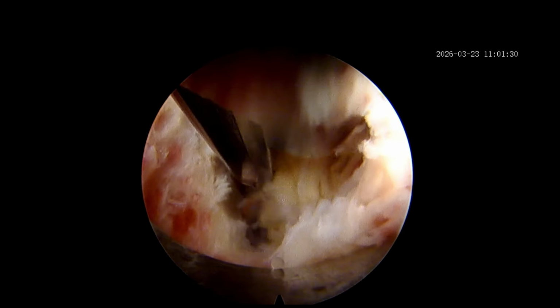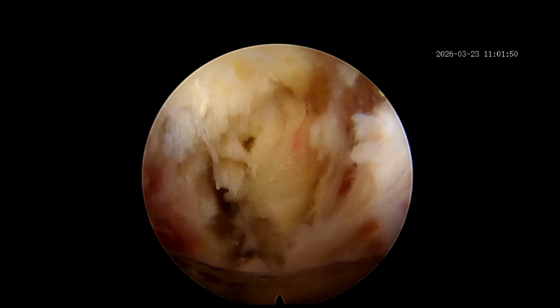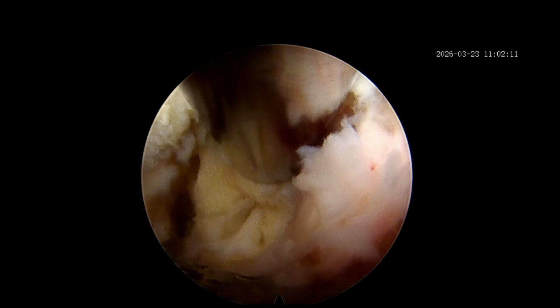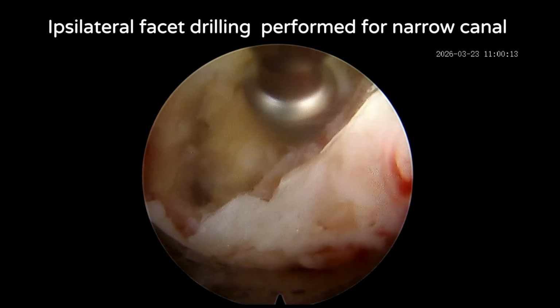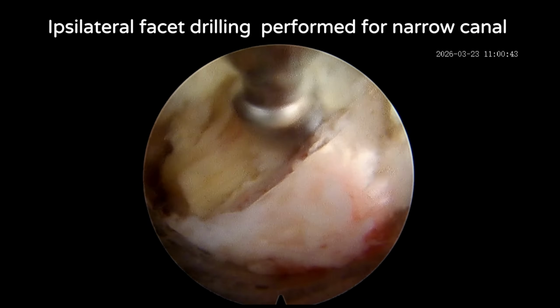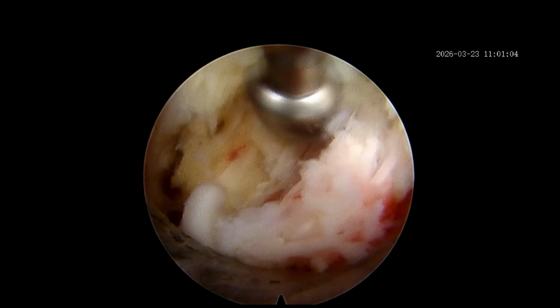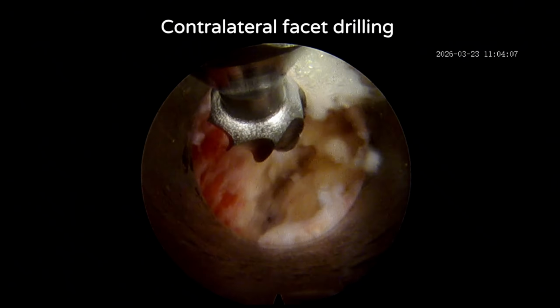You have to make sure whatever you are removing, you should see it first. If you are looking at the fat, then you are 100% sure that dura is down. So you have to be 100% sure. If required, you can do the ipsilateral or the contralateral facetectomy. It should be limited, as your instrument can go down, reach inside, and you can do the decompression well.